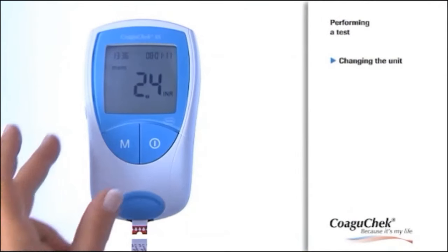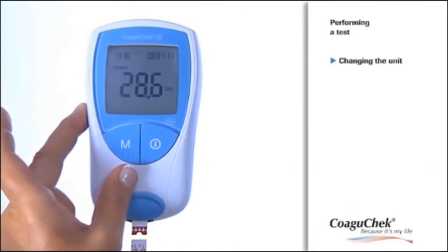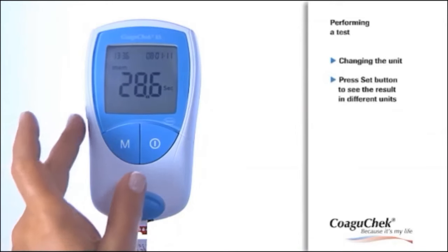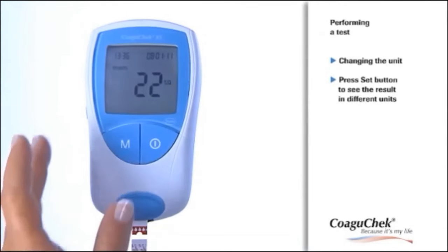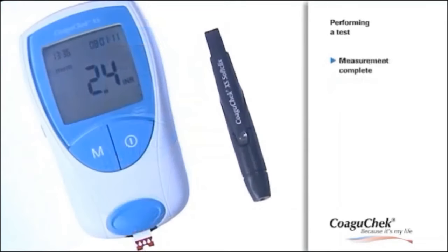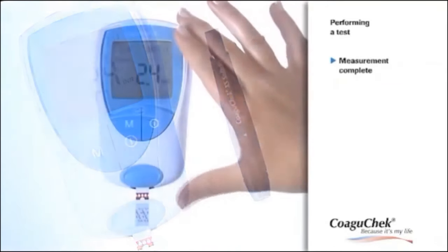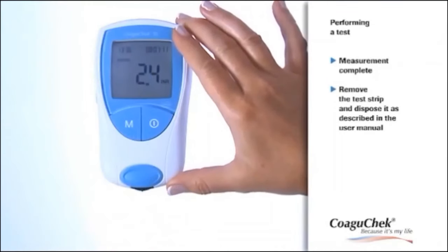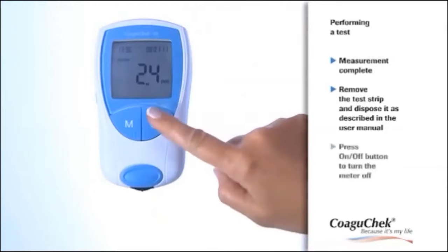Now you can change the unit if you wish by pressing the set button. The result of the actual measurement is displayed in the INR value, in seconds, or in the quick value. Congratulations, you have successfully completed the measurement. Please remove the test strip and press the on-off button to turn the meter off.